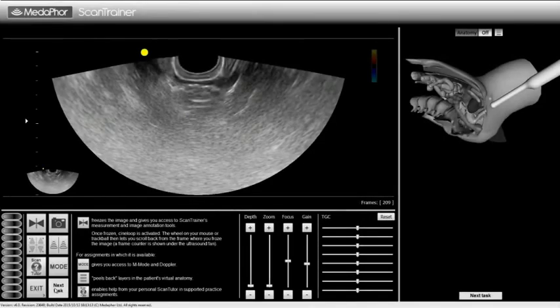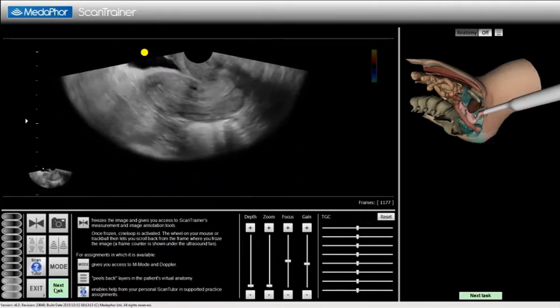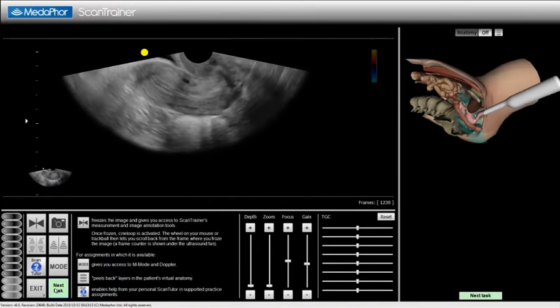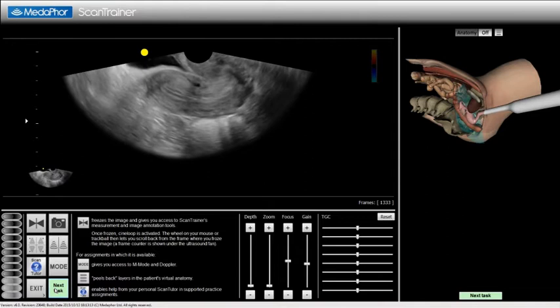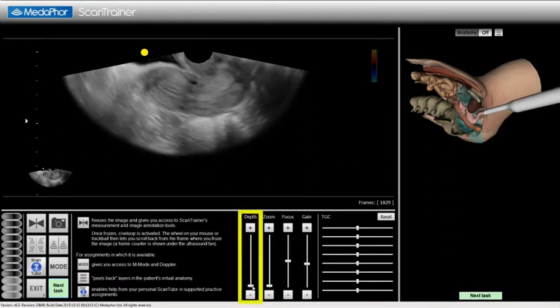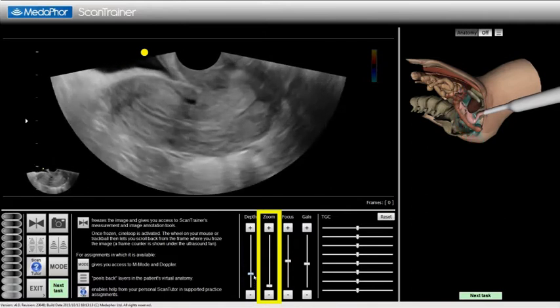Orientation in the sagittal and coronal planes. I now introduce the probe in the sagittal plane and keep the probe pointing downwards and posteriorly, ensuring that the endometrium and cervical canal are shown along its full length. If necessary, adjust the depth of field, then zoom to ensure that the uterus is centralized.